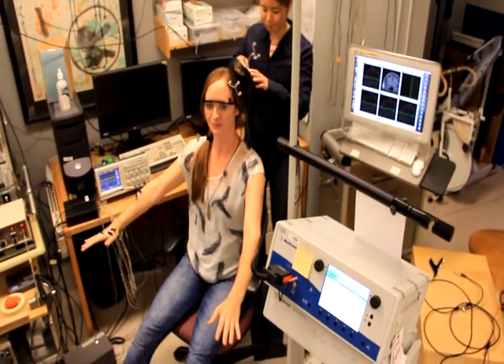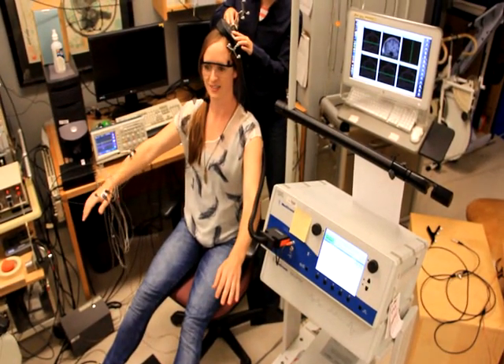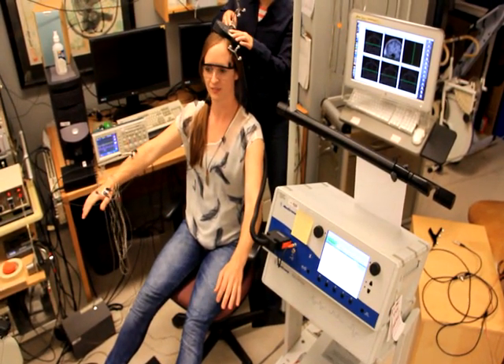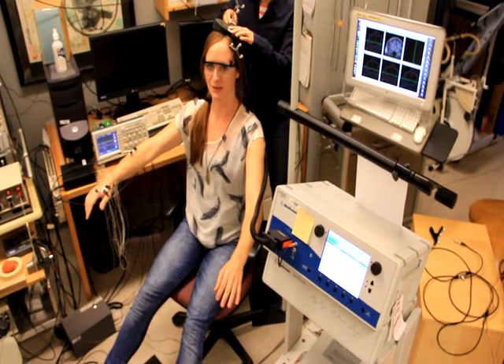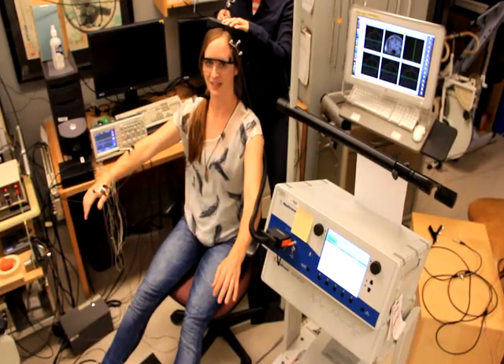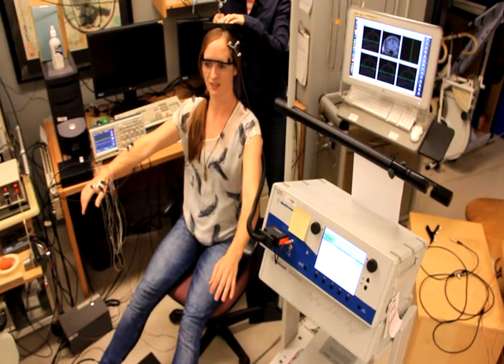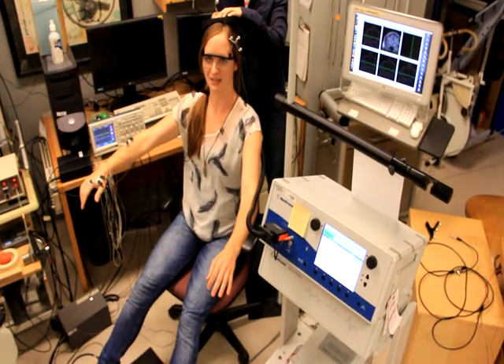So here we go. Right hand, a little bit of elbow, some shoulder and leg, still right leg, and a little response in my left leg there.